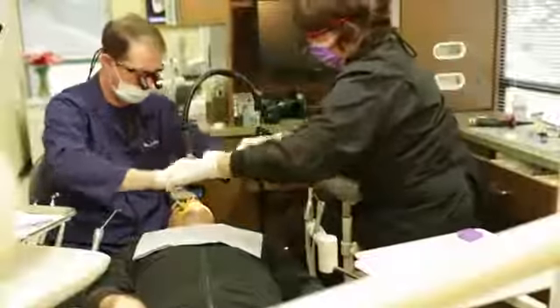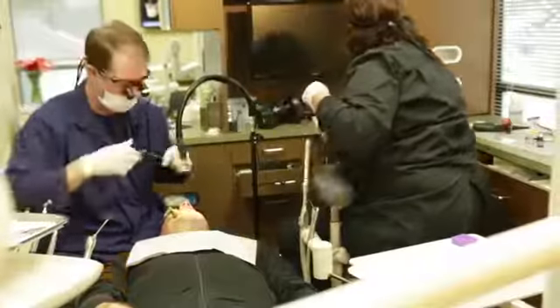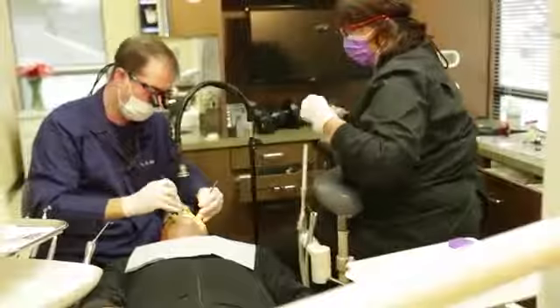Air dry. Donna has loaded the crown. Hold it in place, and she will tack cure it. If you'd like, you can wait 2 full minutes. We go after our interproximals first. Finger. Donna's going to put her finger down and hold the crown because the cement is not set yet. I use an interproximal carver to clean the cement. It all comes off in one piece. Look at the lingual, just flakes off like that.